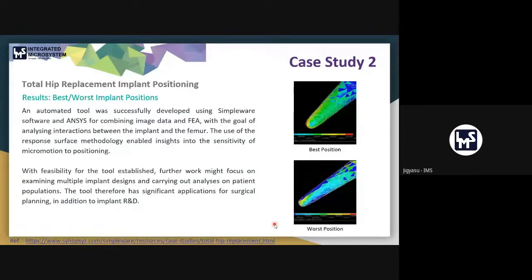Okay, I got your point. Although one single frame can be imported, the finite element mesh elements that are tetrahedral elements are three-dimensional, and that would require the third dimension that we don't have in this case. So I believe if you have multiple stacks of images, one after another, then you can import and very easily create the finite element model here. Okay, okay. Thank you so much, sir.